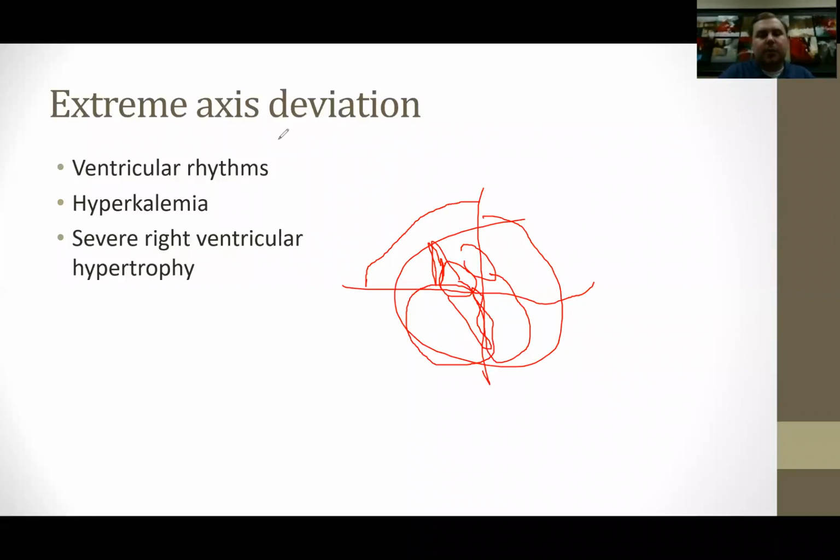The reason it's so simple is ventricular rhythms. Most of those patients are going to be obvious. They're going to be your cardiac patients, patients with weird pacemaker placement. Pretty easy to identify. Hyperkalemia, you're going to look at them with just your history of present illness and your assessment. So they have a history of renal failure, diabetes, benign prostate hypertrophy, and hypertension.